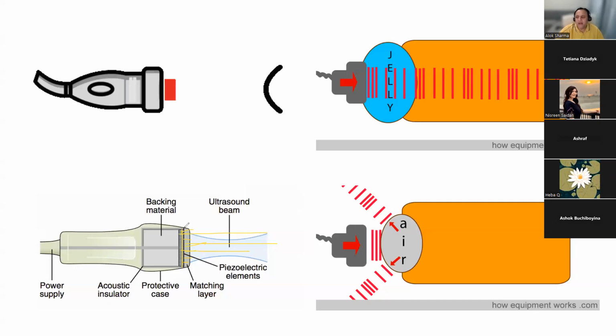So you have all of that incorporated into this particular probe that you see, with the element of a protective casing, and that's very important. The protective casing basically protects these piezoelectric crystals. Now just remember, if you drop this probe and it hits the floor, bang, then you're going to run into real trouble. Not only that, there's a real risk in these circumstances that you'll end up damaging the piezoelectric crystals.